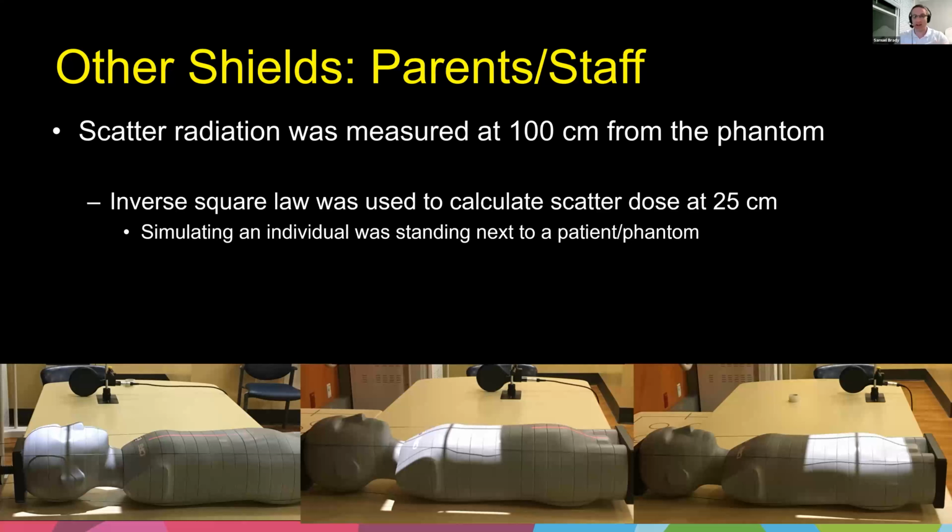Then we walk in and we turn the light on, and I explain it to them. I say, see where that light is? That's where the radiation is going to be, and that is what we need to make an image. We're not going to use any more. Then I point to outside of the light field and say, you see how there's no light here? There will not be any radiation here. We could place a piece of lead or an apron here, but it's not necessary.